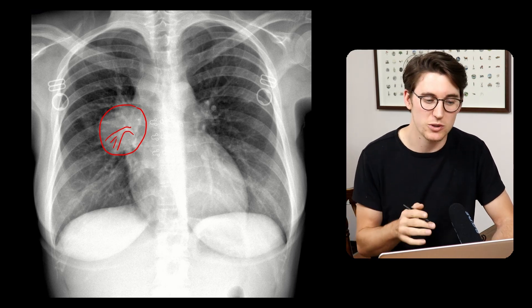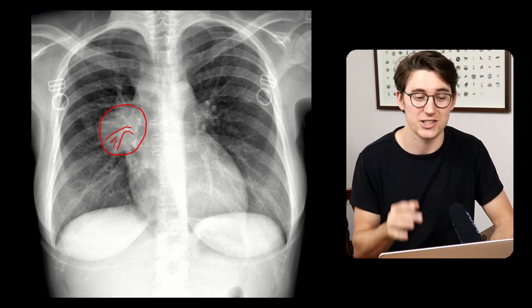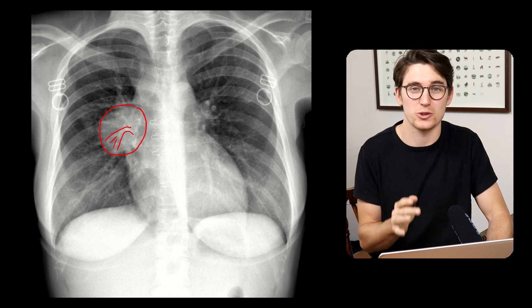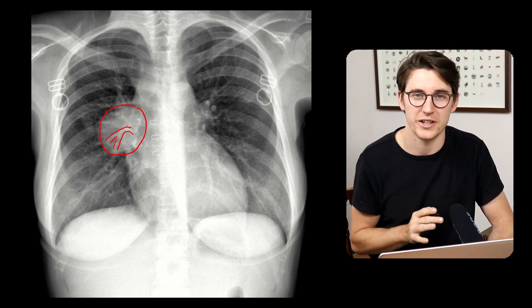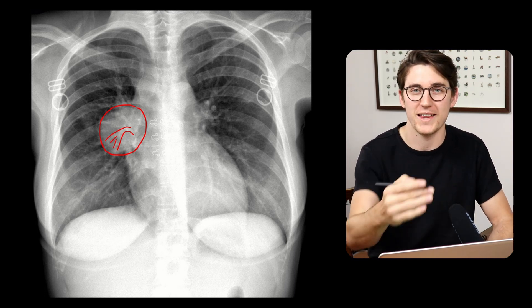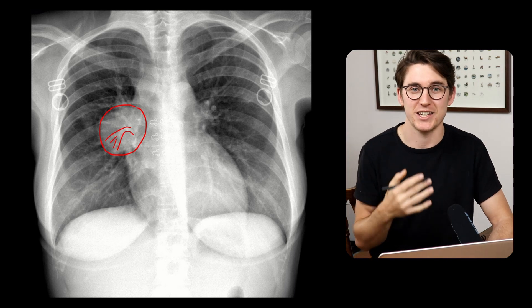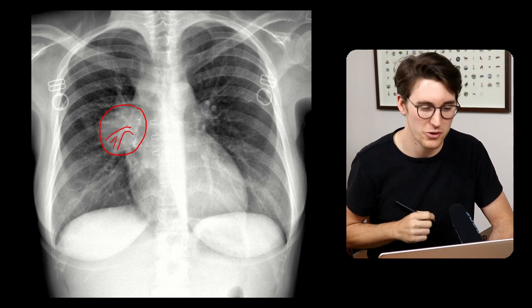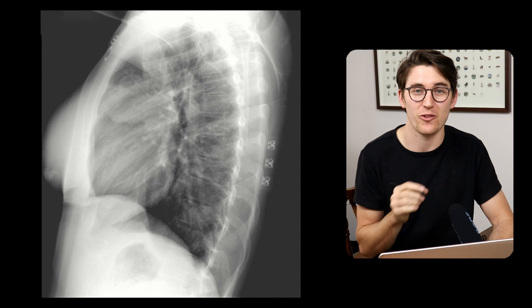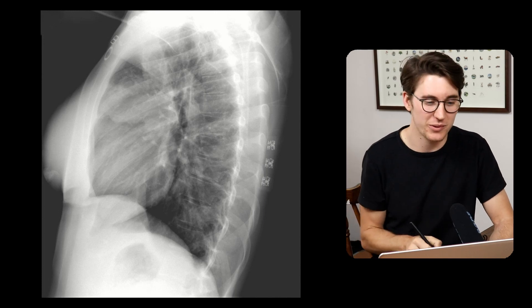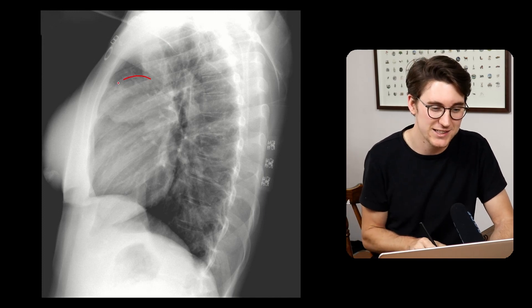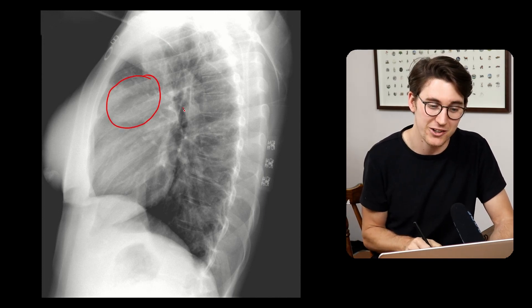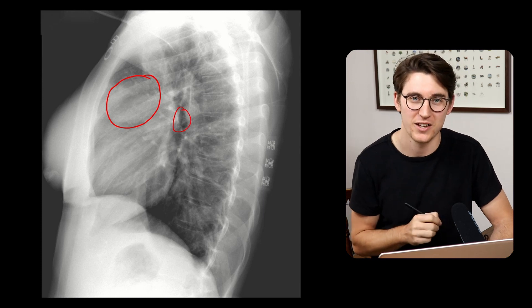This is known as the hilum overlay sign, and it's a really powerful tool — especially if we only have a frontal radiograph — to determine where that mass is sitting, whether it's anterior, posterior, or within the pulmonary hilum. Luckily with this radiograph we also have a lateral, and we can clearly see that the mass is sitting within the anterior mediastinum and not within the pulmonary hilum.